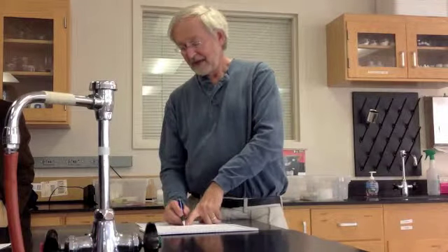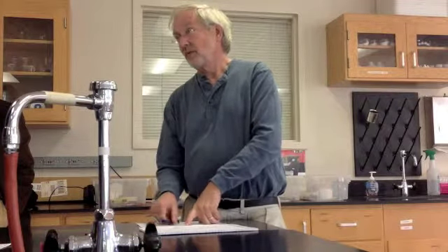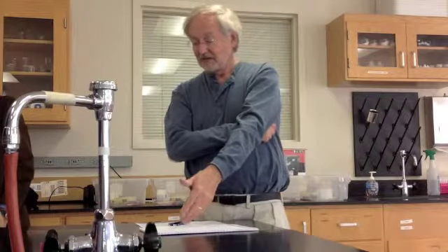Another way of doing that is just clicking something. So you visualize oxygen going through that many stages, that many orifices. And you just click from one orifice to the next, openings in the line. But that's one way of doing it. So you have fixed oxygen on one side, all you do is change the orifice between the supply side and the patient side. And you go one step at a time.